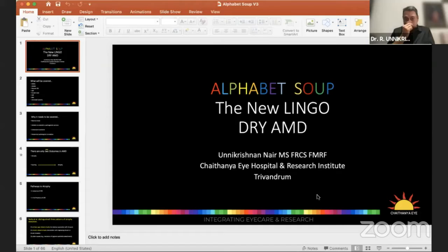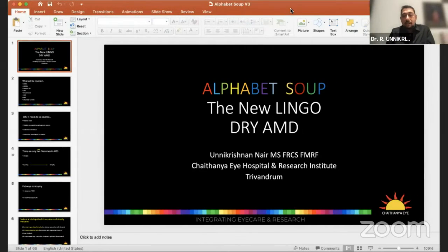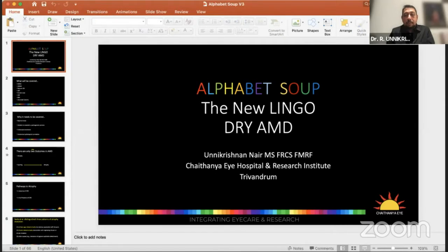Good morning, everybody. We'll be doing quite an important IC hopefully today, which we call alphabet lingo, because of all the new terminology that has been introduced inside retinal imaging. We'd like to demystify and decode it a bit for you and reinforce what we said with a small interactive session after that. I will be doing the first talk in the session, which will be mainly centered around dry AMD. I'd like to welcome all the co-instructors and speakers before I start, and we'll be starting the talk now.